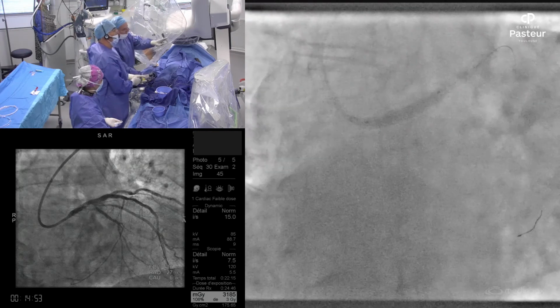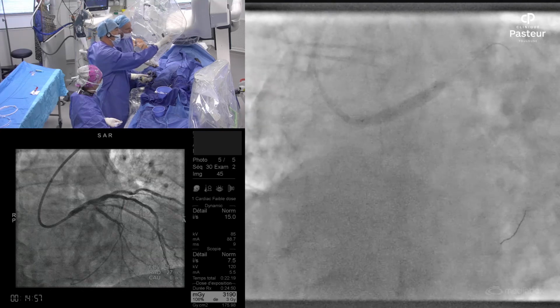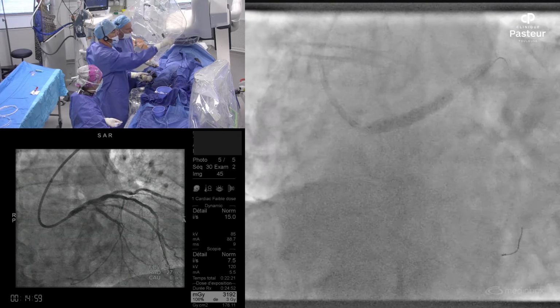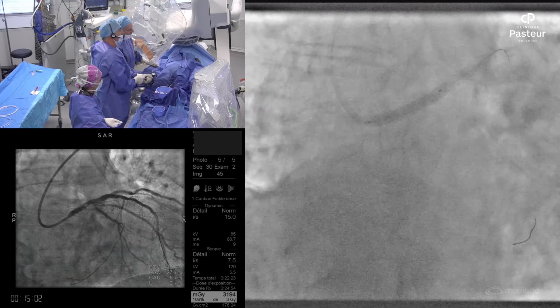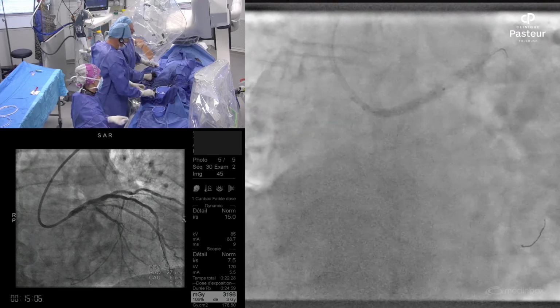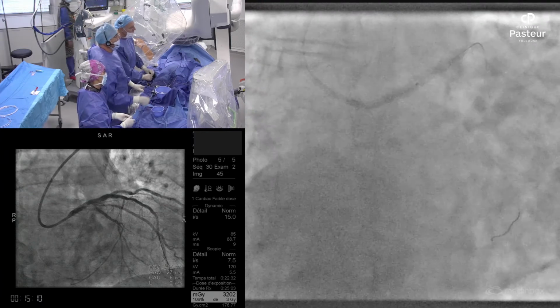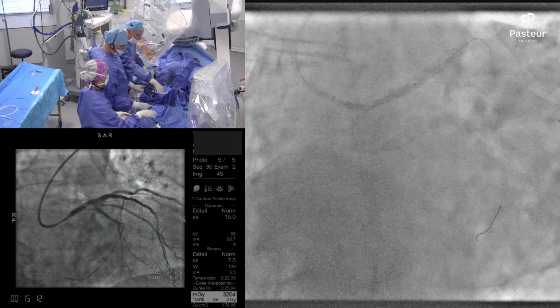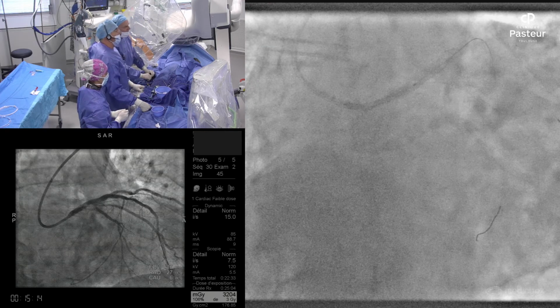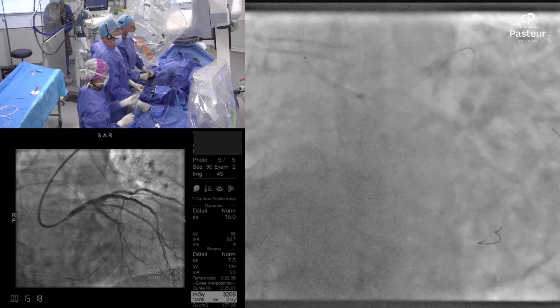And we are in the left main, not touching the bifurcation. So that's okay. And you see the distal marker is at crossing just the OM branch, the OM wire. So now it's time to. Good. Okay, let's give time. So it takes time to deflate. After we do the POT, because 4-0 is probably not enough for this left main, and probably we need a 5-0.